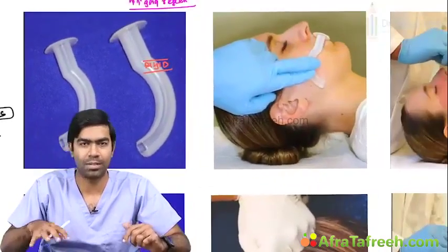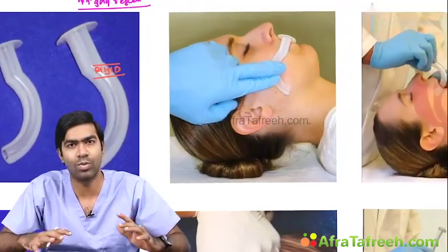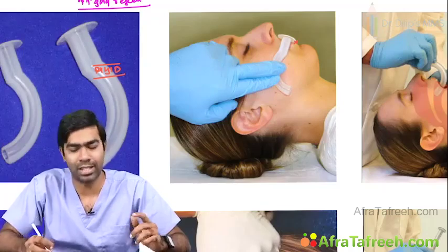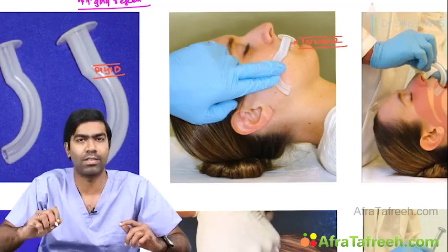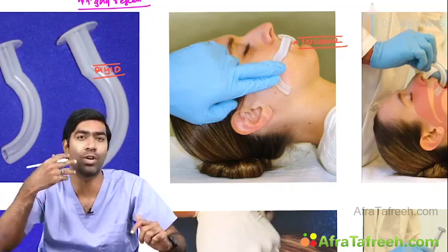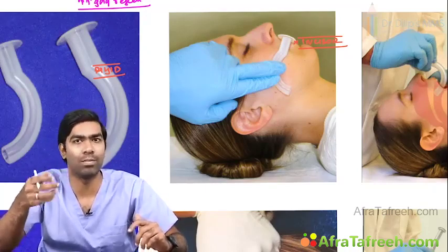Clear? They are PVC, rigid plastic tubes, and they are available in different sizes. So this is how you are going to select the size of the oropharyngeal airway. Here you can see they are placed near the incisor. Remember, incisor is a very good landmark. Incisors are a very stable landmark in most patients compared to the angle of the mouth. Even though some books tell you to use the angle of the mouth, the angle of the mouth is prone to deformity. They can be like this, they can be like this, but incisors are relatively more stable landmarks.